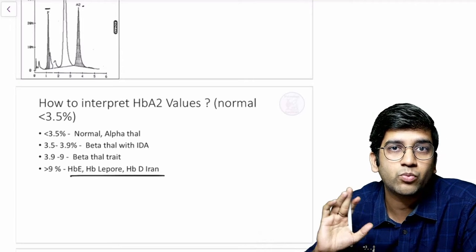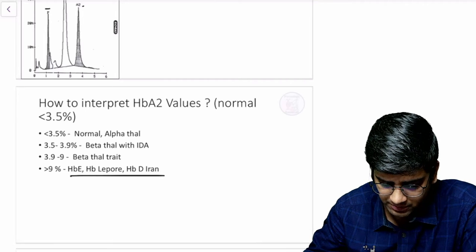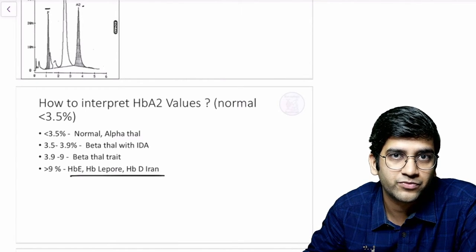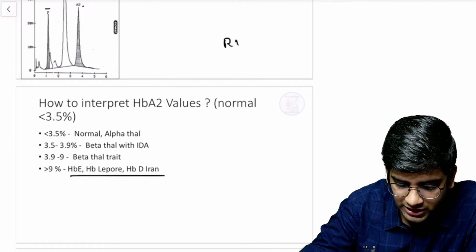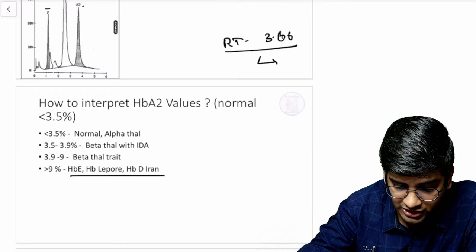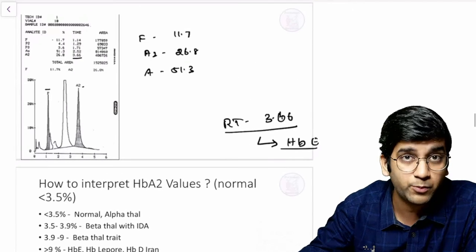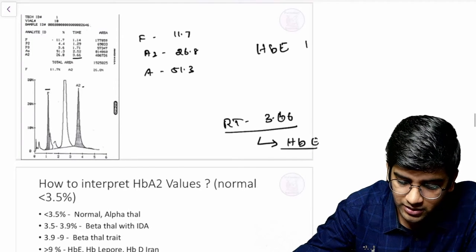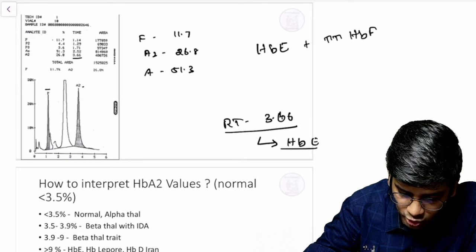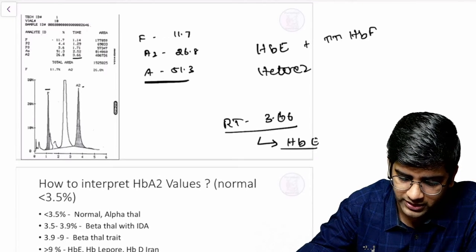this was given by one of my close friends and my senior, Dr. Bishwajit, who works in NIGRIMS. It is shared by him, right? So here, this tiny thing, 3.66 is my retention time here. Retention time, like I said, is calibrated based on the machine. The machine calibration of 3.6 as retention time for this particular case was equivalent to HbE. So they have reported that as HbE plus abnormally elevated HbF. And I do have good quantities of HbA, right? So is this HbE heterozygous or homozygous? Obviously it's heterozygous, right?